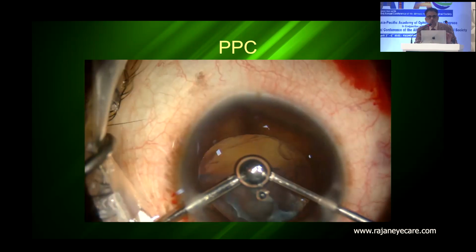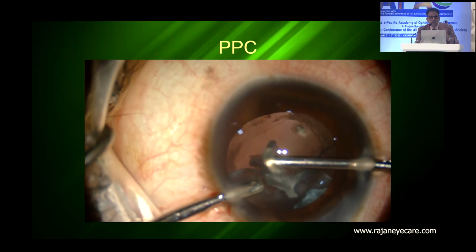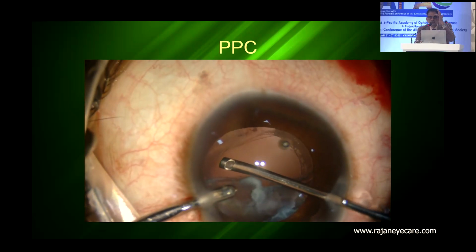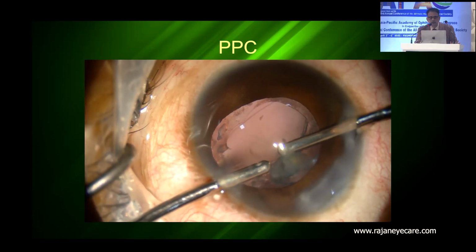Create a side port. Don't use the main port. Create a side port. Do an anterior vitrectomy. Put triamcinolone. Keep this in your mind always. At that time when you become jittery, when your adrenaline is flowing, you'll forget everything. Okay? And you can see here.